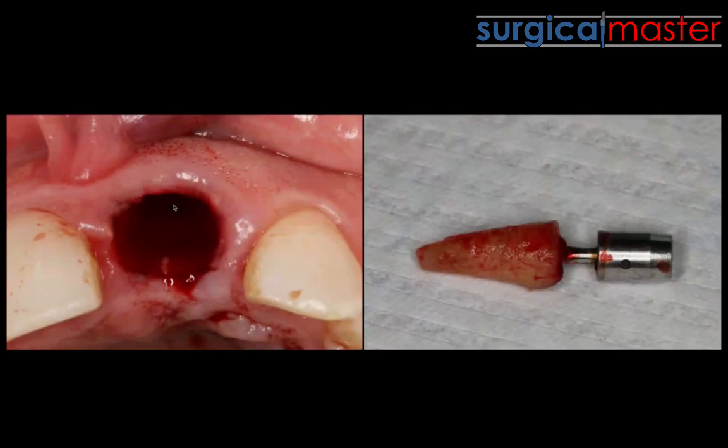And all of a sudden, a very difficult extraction turns into a super simple extraction — it's ridiculously simple. It's not for every case: if a tooth has ankylosis, it's not going to work; if the tooth has significant curves, it's not going to work. But central incisors are usually straight, so it works well for them.